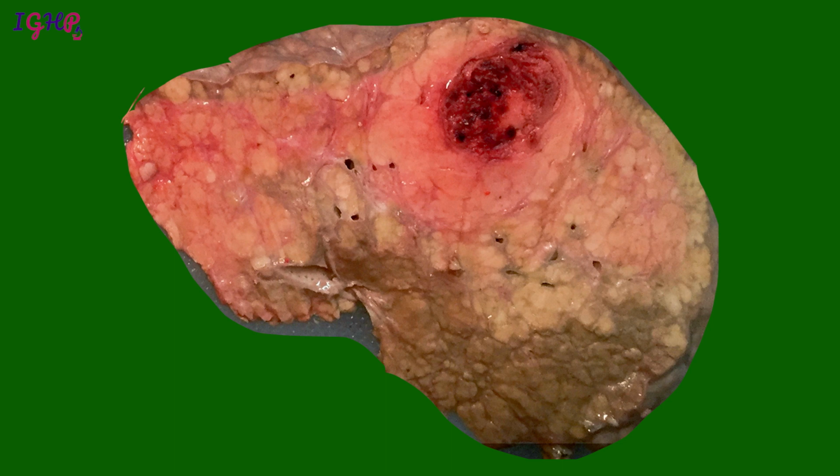Now another lesion, if you see here, in this lesion, as we could see, the margins are not well defined.